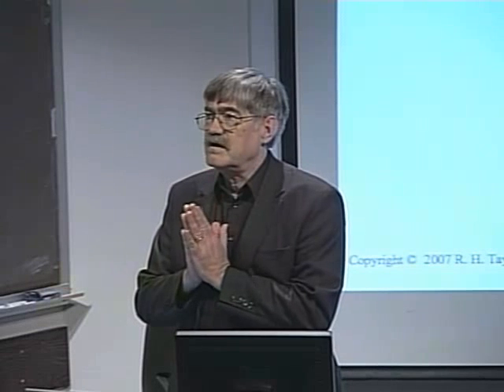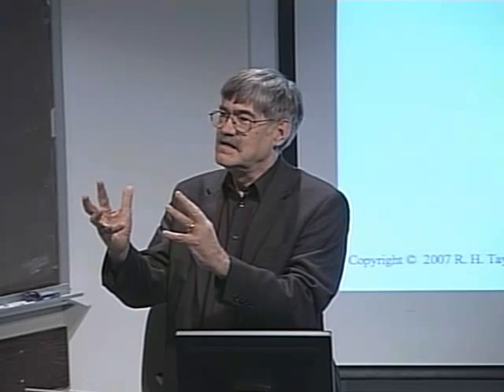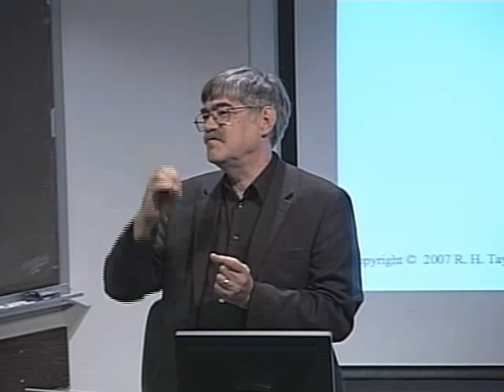Another area, which I kind of alluded to, is being able to do the vision processing and the information fusion in real time. The environments inside the body are sort of red, but they're complicated. You have glares. It's very challenging to deal with these real-time deforming environments and keep track of where you are. I didn't talk about some of our other work, where we're trying to build up these real-time models as you move an endoscope in a patient, and then to track.